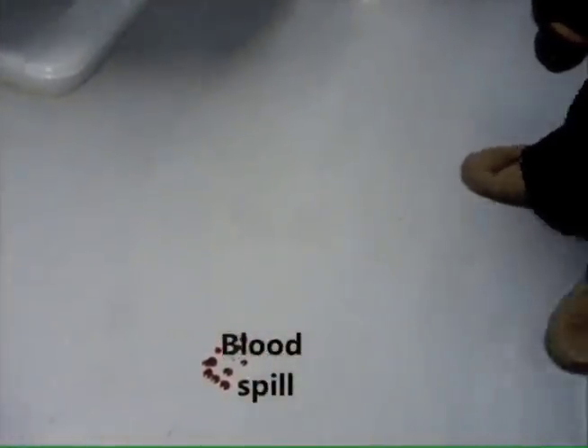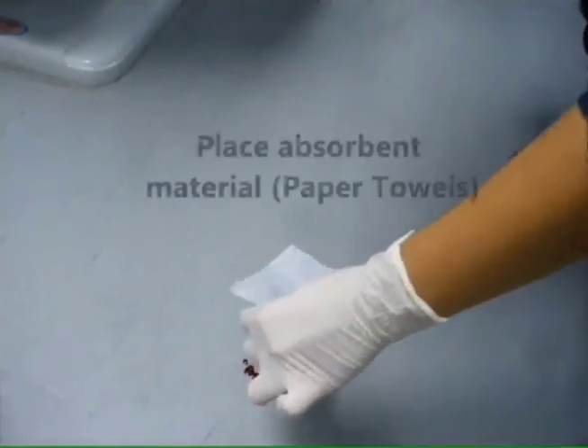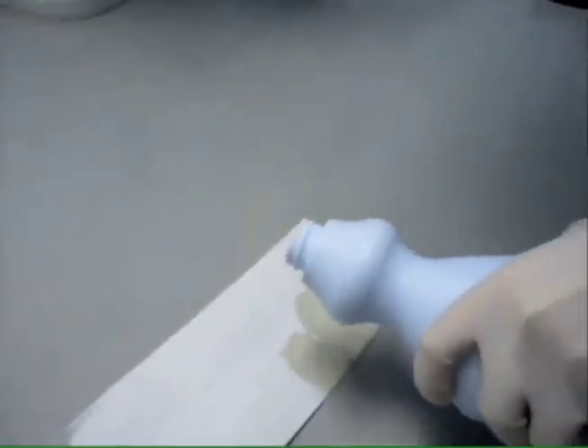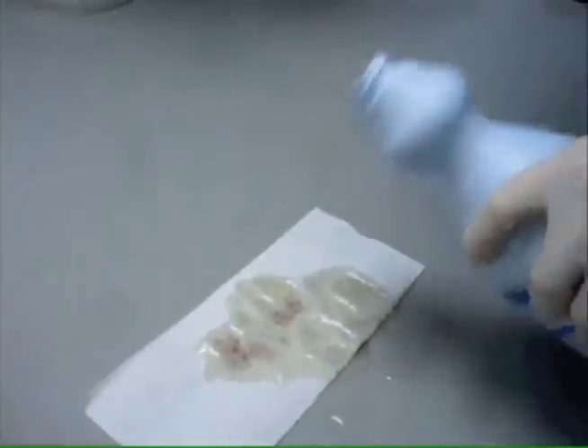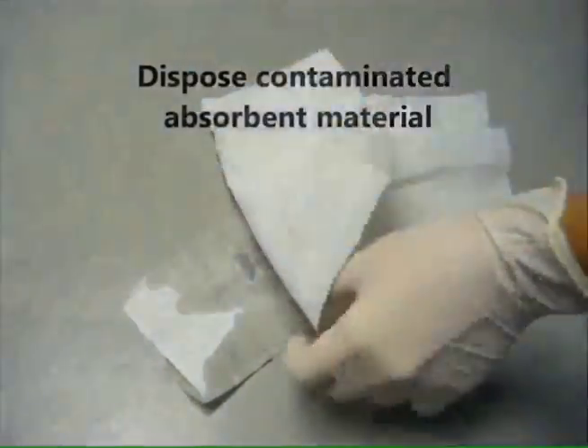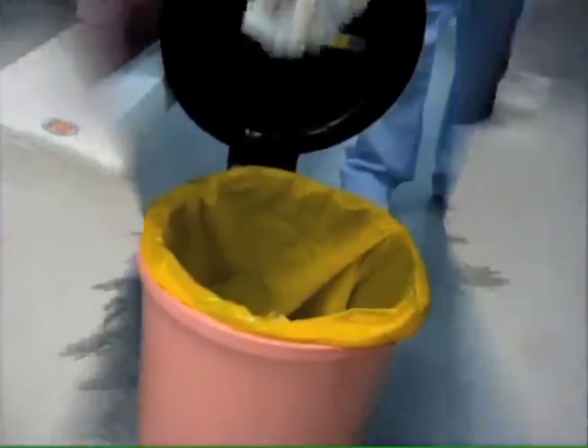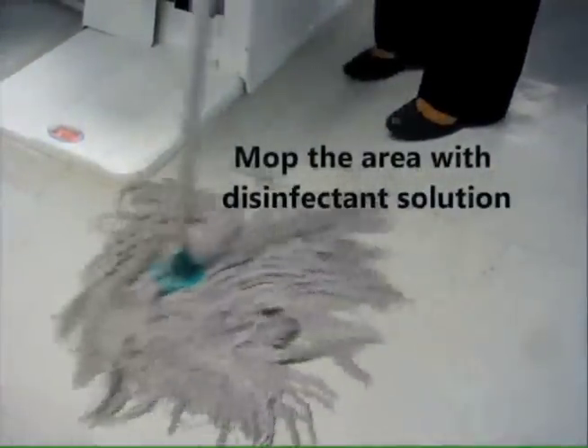Blood spill management. First, place an absorbent material on top of the blood spill, for example, paper towels. Use full strength sodium hypochlorite, commonly known as bleach, and pour sufficient amount on top of the absorbent material. Leave it undisturbed for 10 minutes for the sodium hypochlorite to take effect. After that, dispose contaminated absorbent material by covering it with one or two more layers and wipe it clean with gloved hands. Dispose the material into a biohazard waste bin. Lastly, mop the area with a disinfectant solution, for example, diluted sodium hypochlorite.